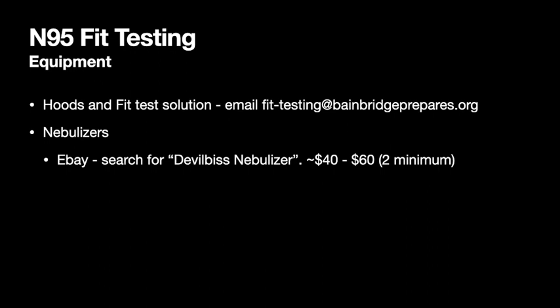A note about equipment. If you are having trouble getting either hoods or fit test solution, you can email us at fittesting@bainbridgeprepares.org. We have partnered with a local company to create replacement hoods, and we have partnered with a chemist to create our own bitter fit test solution. In terms of nebulizers, which is the other key component of a fit testing kit, we have had luck going on eBay and searching for DeVilbiss nebulizers. And you've seen in these videos how they look. You're going to want a portable nebulizer, and they run about $40 to $60. And remember, you're going to need 2 of them.